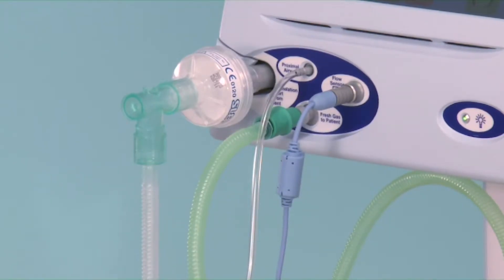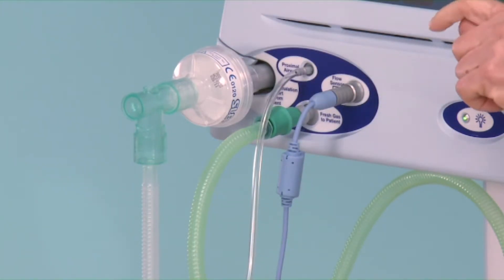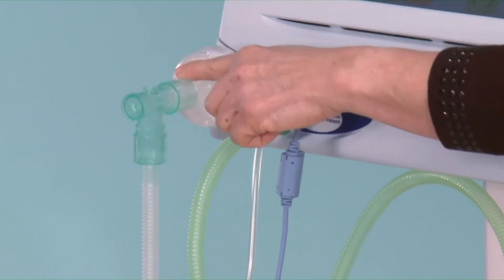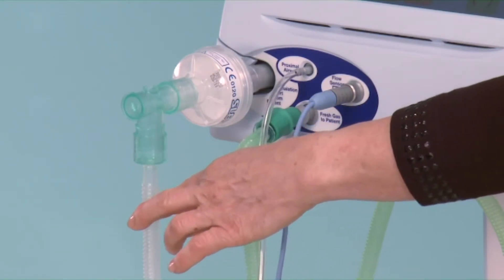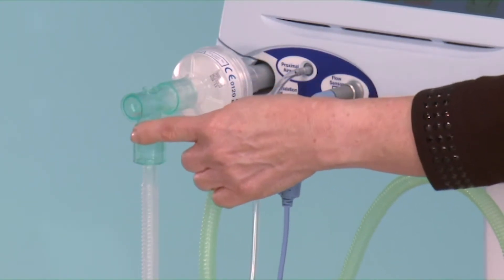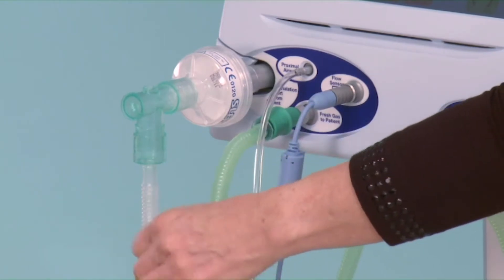If the protocol in your unit is to use a single-use bacterial filter on the exhalation block, it must be changed every 24 hours or as soon as you see some condensation in the neck of the filter. If the filter gets wet, it builds up a resistance in the circuit and you will end up with a higher positive end expiratory pressure. To overcome this issue, we now have a right-angled connector in the packet with the patient circuit, which prevents water from getting into the bacterial filter.